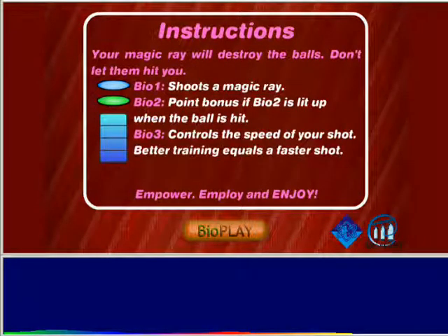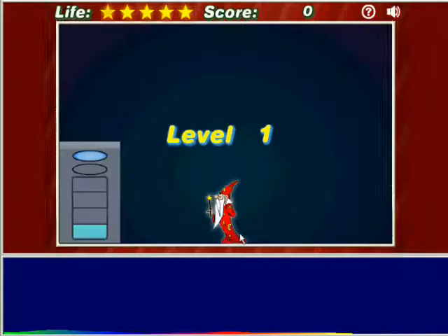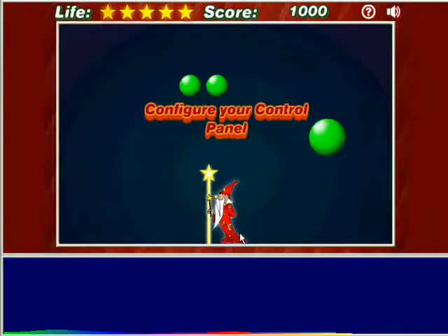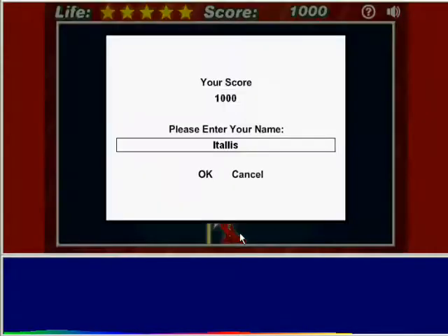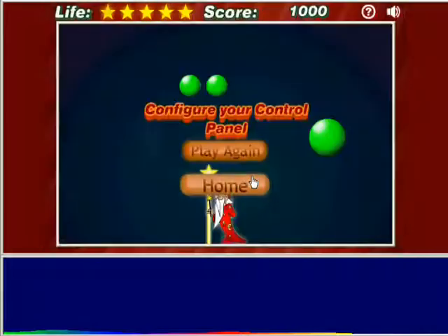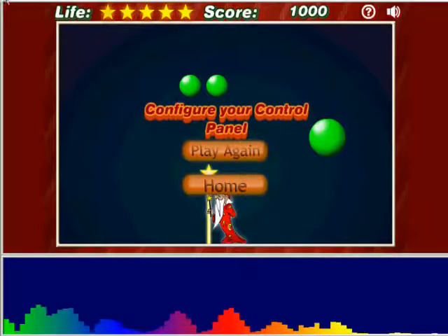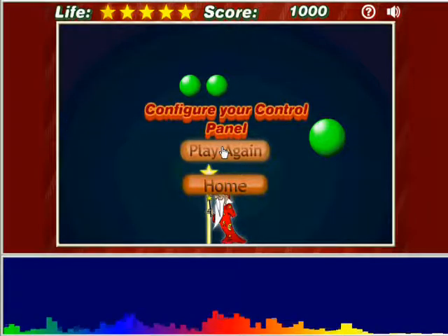Begin your training session before starting the game. If you start the game first, you may see the message: configure your control panel. Begin your session and press play again, or if for some reason the game does not begin, press home and then BioPlay.